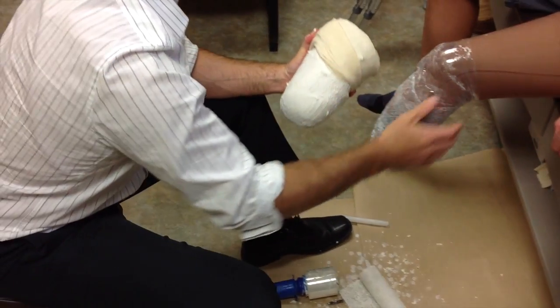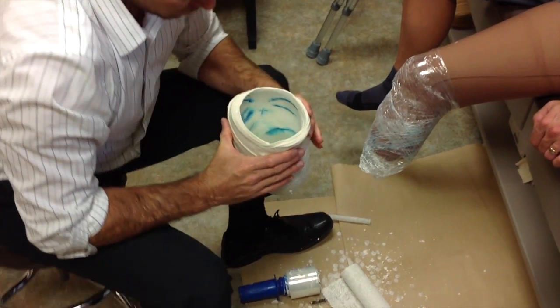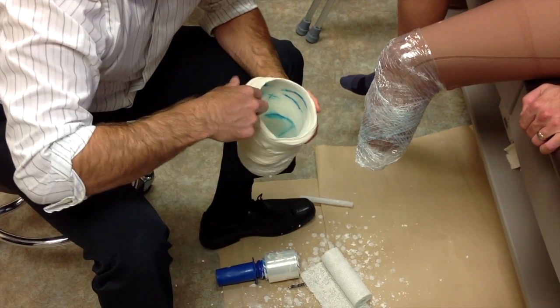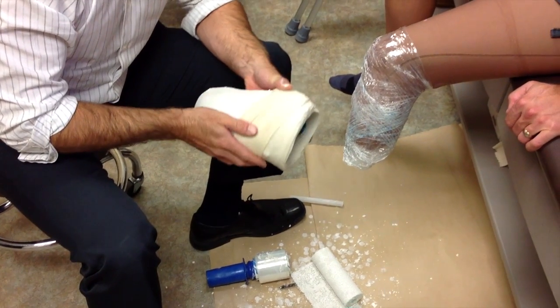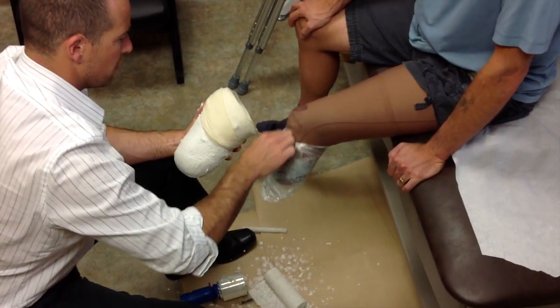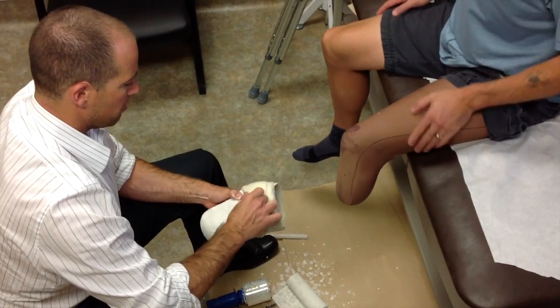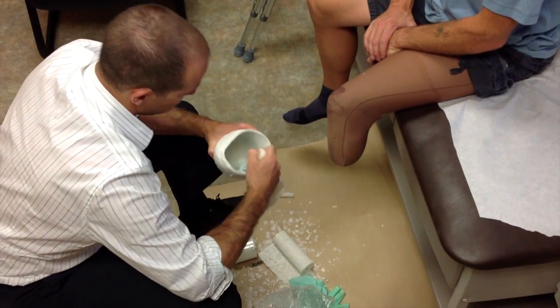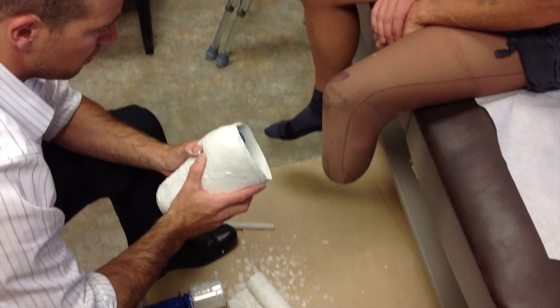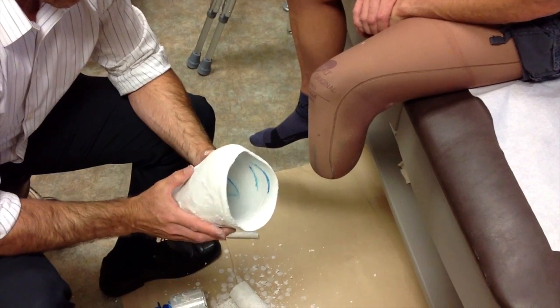And there you have it — you have both worked together to capture the shape of the residual limb for your first check socket. Looking down inside the impression, you can see that the indelible pencil transferred onto the inside layer of the impression. The plastic layer can be discarded, the cotton stockinette can be removed, and there you have it: a beautiful impression that's going to result in an excellent fitting socket.